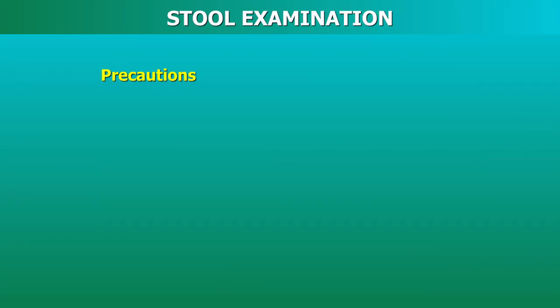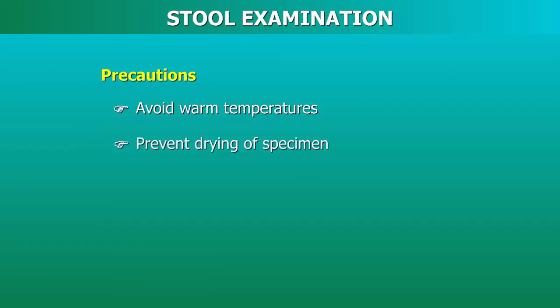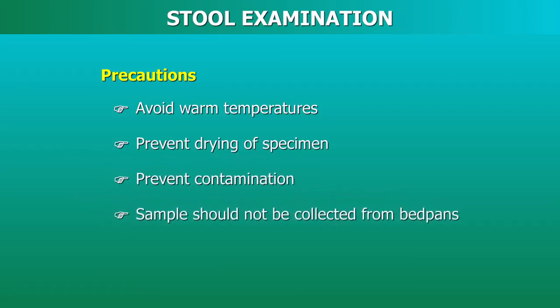Precautions. Do not keep the specimen at warm temperatures. Try to keep it in cool places. Prevent the drying of the specimen. Prevent its contamination with urine or dirt particles. The stool should not be collected from bedpans which contain disinfectants.